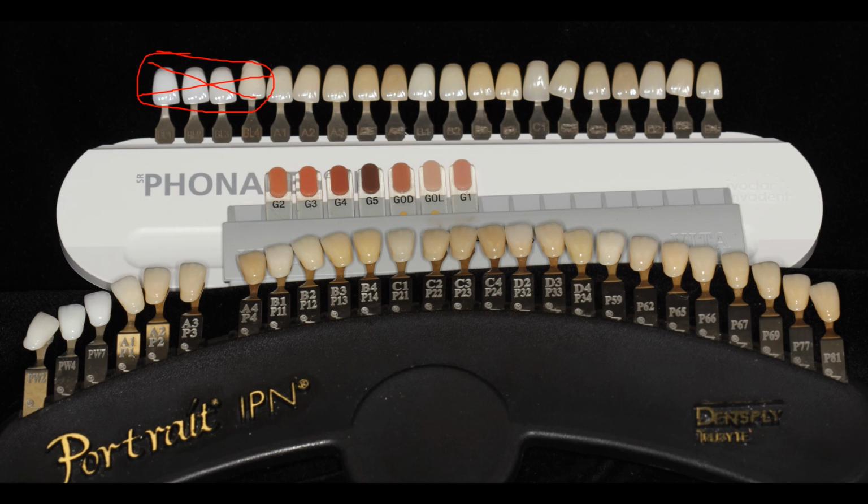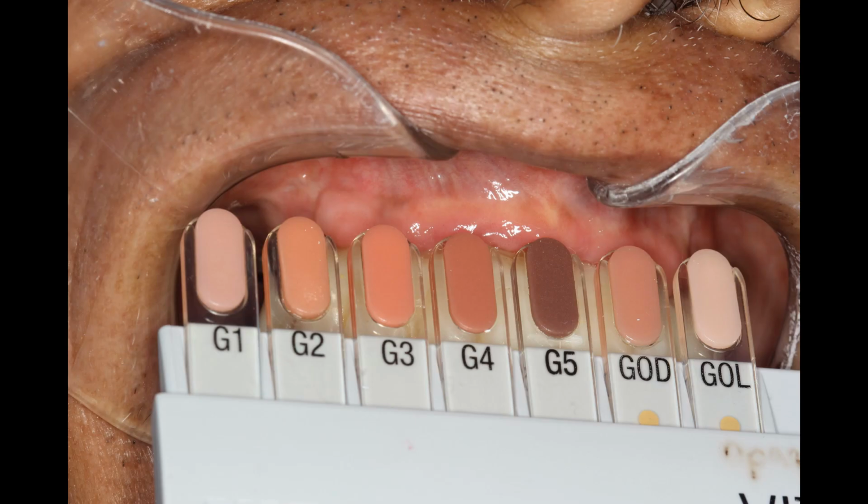So we also have a decision to make on the color of the gum tissues. So we've got many different options, and many times I'll tell the lab to mix and match certain shade tabs. But we can give the patient just about anything they desire. Our gum tissue shades are limited, so we can mix and match these as well.